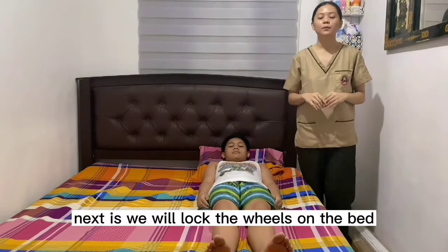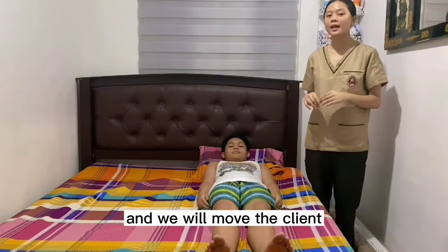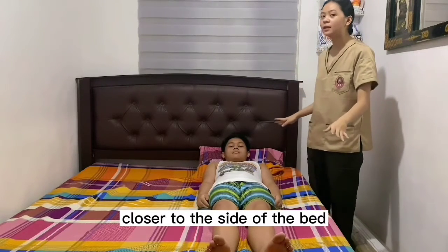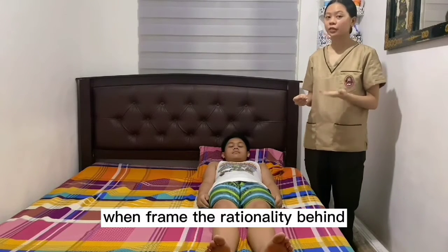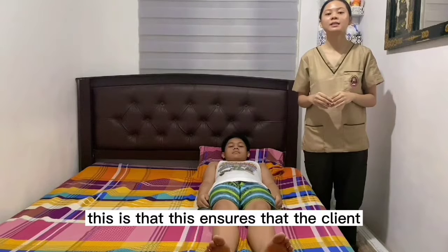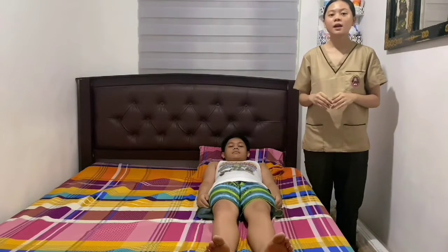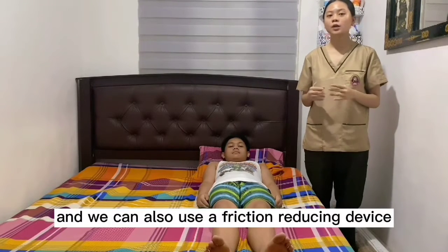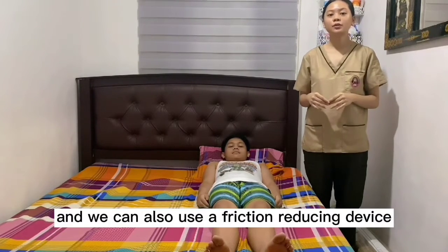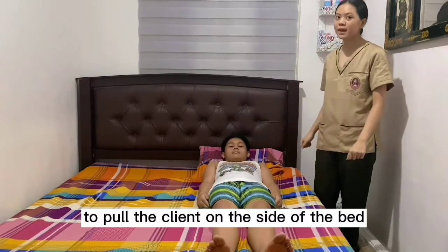Next, we will lock the wheels on the bed and we will move the client closer to the side of the bed on the opposite side from where the client will face when turned. The rationale behind this is that this ensures that the client will be positioned safely in the center of the bed after the turn. And we can also use a friction reducing device or mechanical lift to pull the client to the side of the bed.